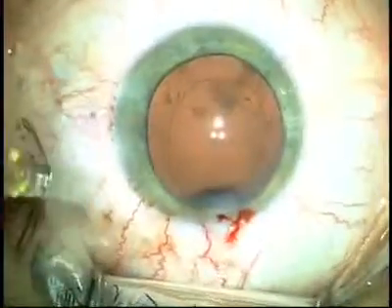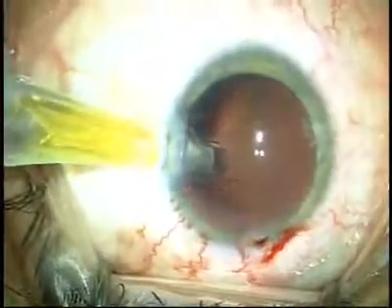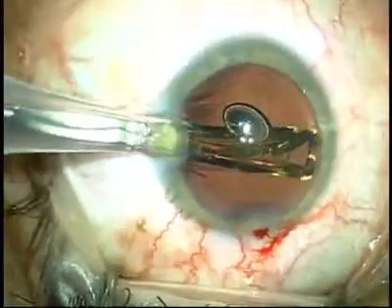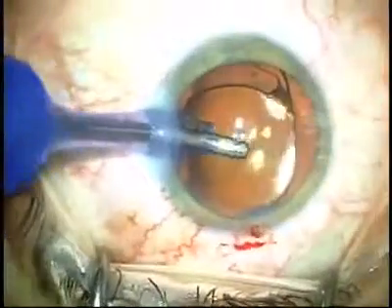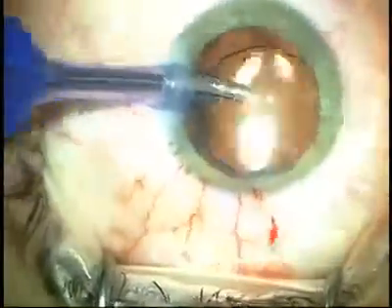I especially like this soft shell technique of Healon and Healon 5 when I'm using the AcrySof Toric Lens. The Toric Lens requires complete evacuation of the viscoelastic to make sure it's stabilized inside the eye. If you use two cohesive viscoelastics, the viscoelastic tends to come out of the eye much more completely and thoroughly, and I tend to get a more stable IOL and a more stable position of my toric axis.